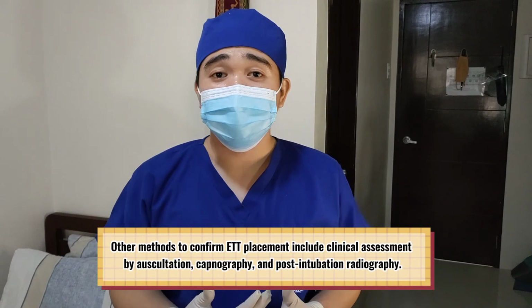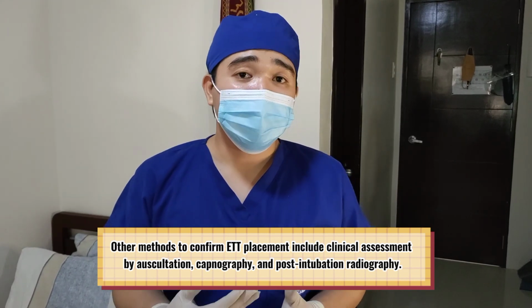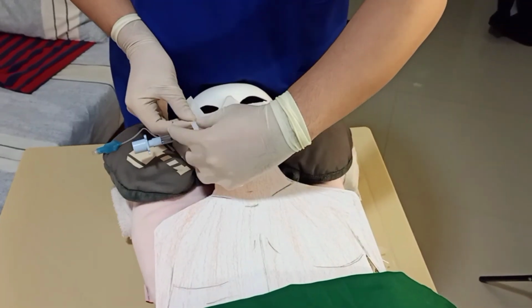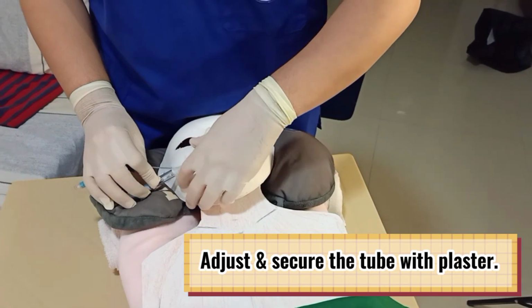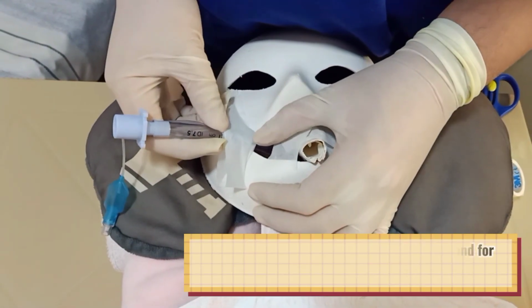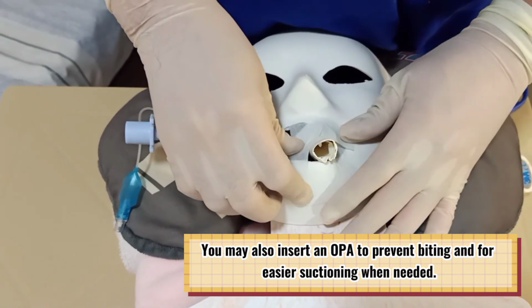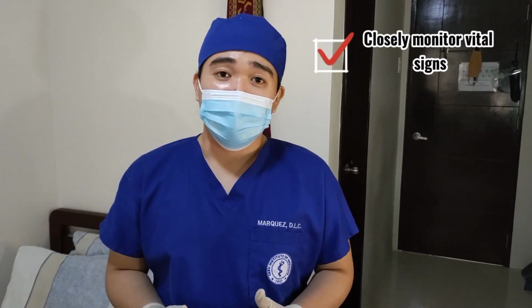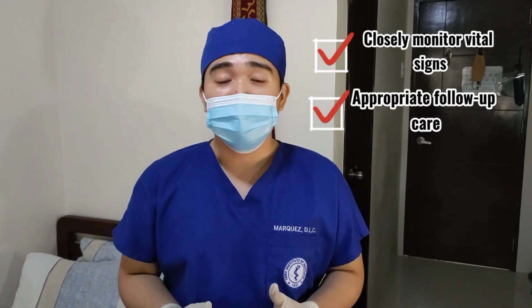Methods used to confirm correct ETT placement include clinical assessment by auscultation, capnography if available, and post-intubation chest radiography. Once equal breath sounds are achieved, then adjust and secure the tube in place with plaster. You may also insert an oropharyngeal airway to prevent biting and for easier suctioning when needed. Now we're done with endotracheal intubation. Now monitor the patient during intubation and provide proper follow-up care in order to improve outcome and quality of life.